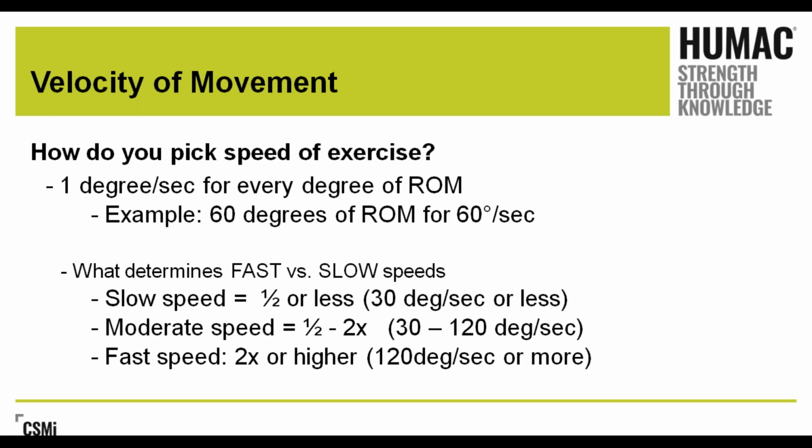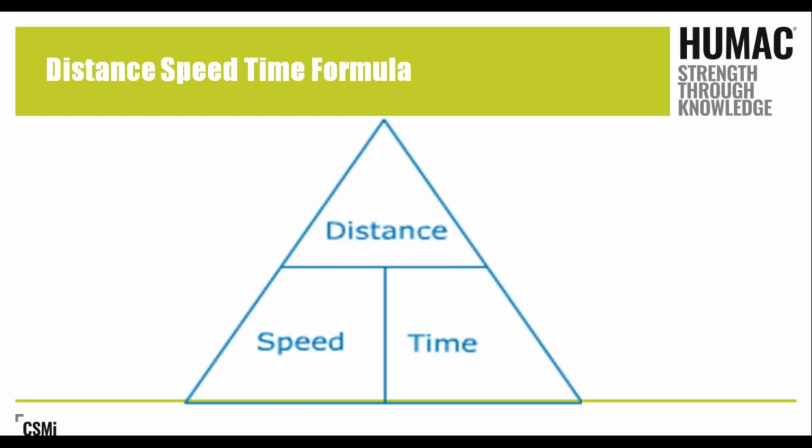Why would we want to use a slow speed? When we've just talked about that high speed eccentrically increases force, we don't always want to increase force early on in our rehabilitation program, right? We want to get mobility, we want to get stability, and we want to get through that neural adaptation for resistive training so that we can train them to be able to do an exercise appropriately. By slowing down the speed eccentrically, we allow them to stay in that eccentric mode for a longer period of time and complete that neural processing, that motor learning that's so important for them to understand how to decelerate eccentrically. So we go into a lot of slow speed training in the early phases of rehab when we pay attention to someone having suboptimal strengthening and or inhibition or neurologic adaptation problems.